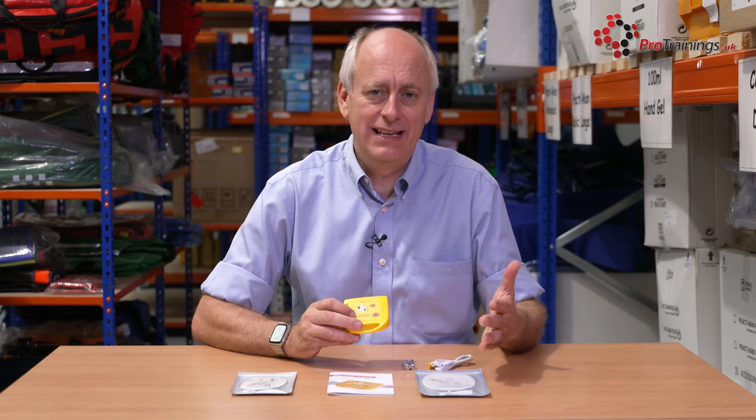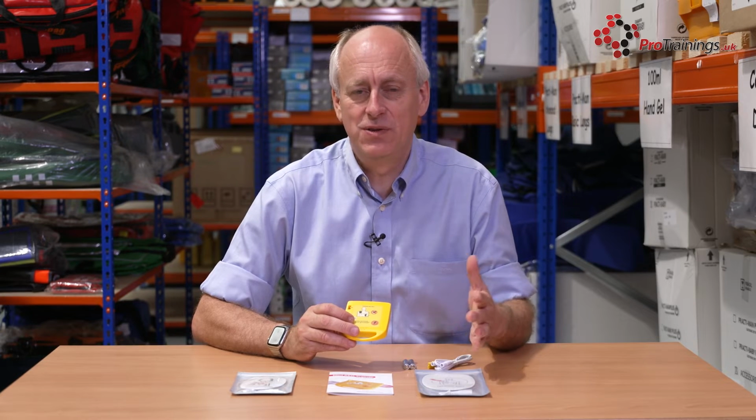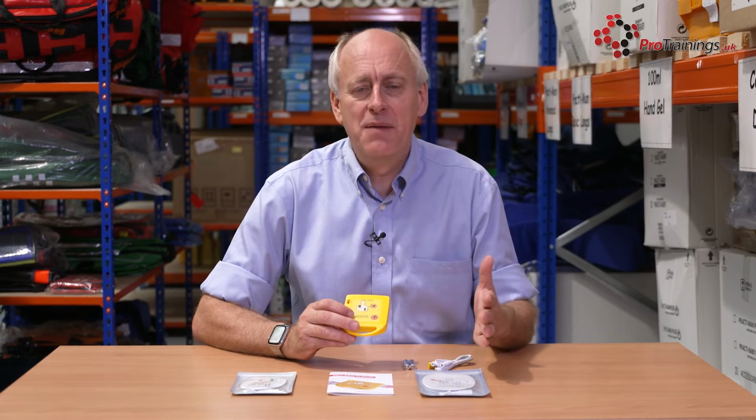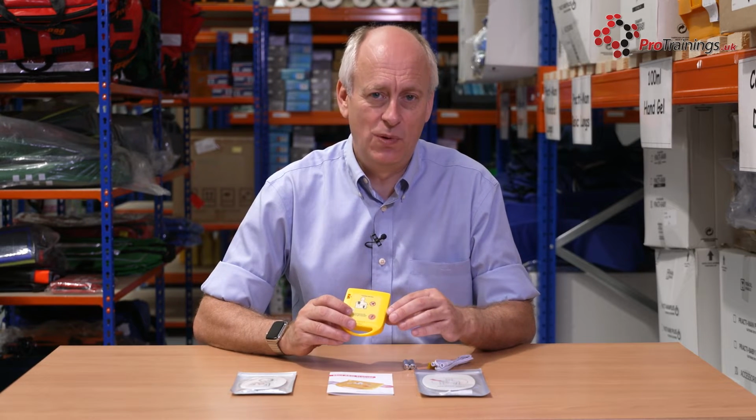replicate a brand, and then have this for the others, because the rules are that you have one AED trainer or pad placer per 4 students. So if you get yourself one proper AED trainer, then you can show students what an AED actually looks like, and then have 2 of these, so when they're practicing, they can practice on a smaller unit.